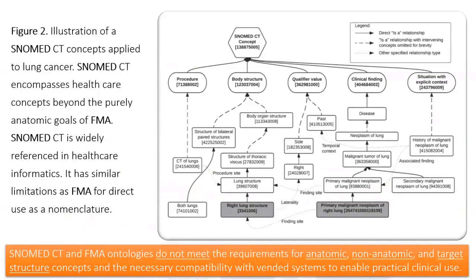And this is the illustration of the SNOMED CT, as we see in the FMA, exactly the same. Both SNOMED CT and FMA do not meet the requirement for anatomic and non-anatomic and target structure concepts, and the necessary compatibility with vendor systems to enable practical clinical use.